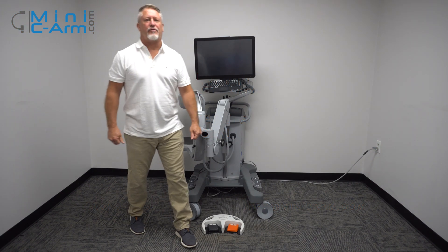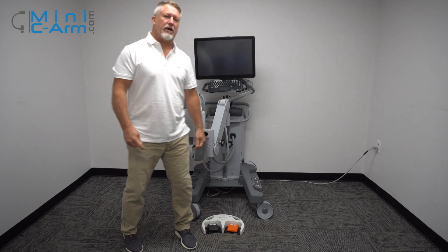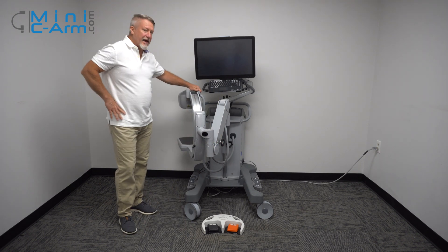Hey guys, I'm Christopher Bacon, founder of OrthoScan, president of minicarm.com. Today we're going to take a look at the OrthoScan FD Pulse.